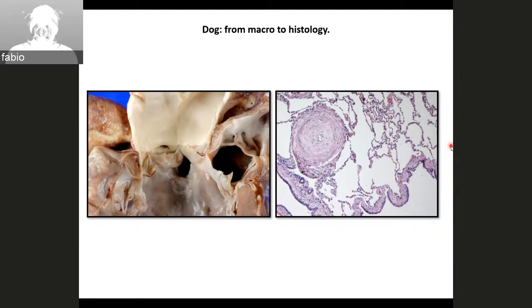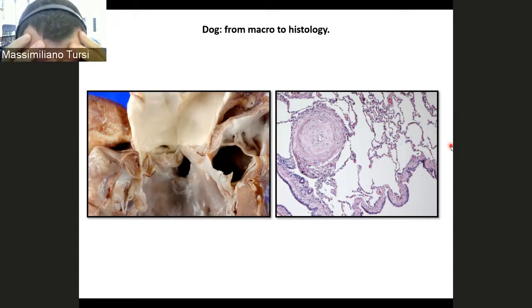Like a structure that is in the lung? Oh, the arteries, sorry, yeah. Okay, the vessel. Okay. Yeah, I was thinking like, because it looks like a picture that I've seen of a plexiform lesion. It's not a plexiform lesion. Okay. If you say plexiform degeneration lesion pattern and such, you have to think about this kind of functional modification.